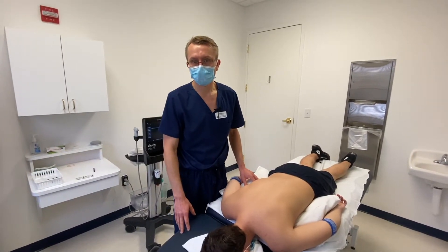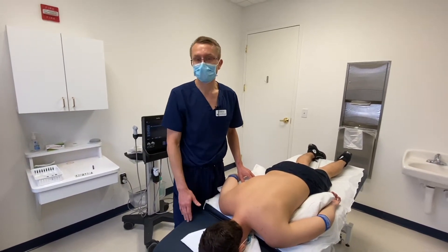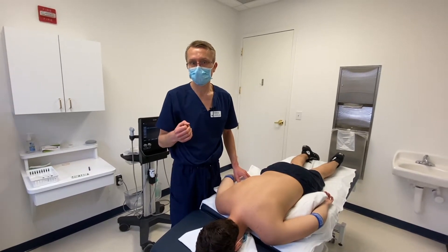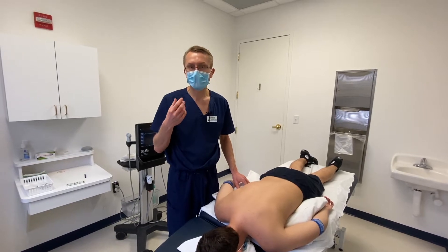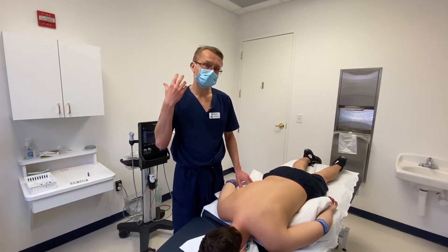Today we're going to be doing prolotherapy of the cervical spine using PRP as our agent. This patient has some hypermobility or instability of the cervical spine, and our goal will be to try to stabilize this.